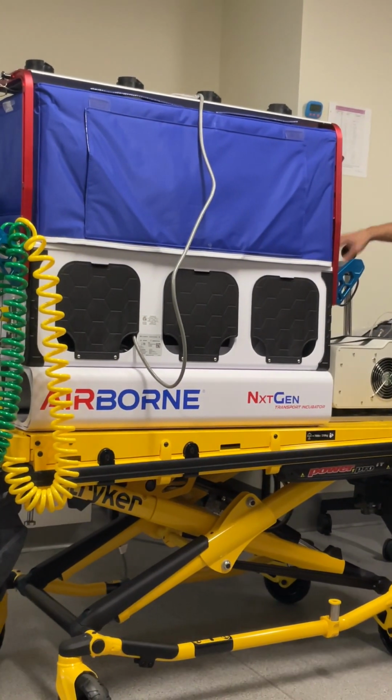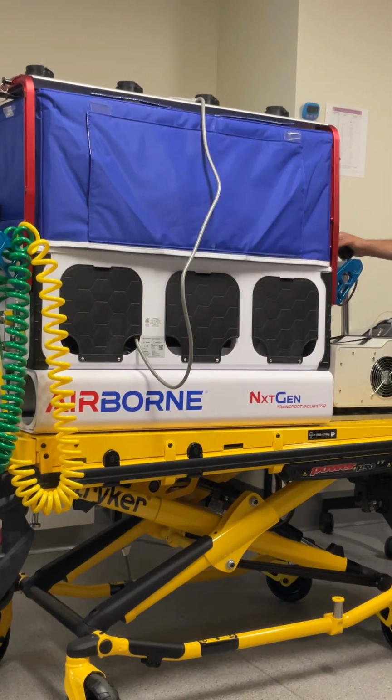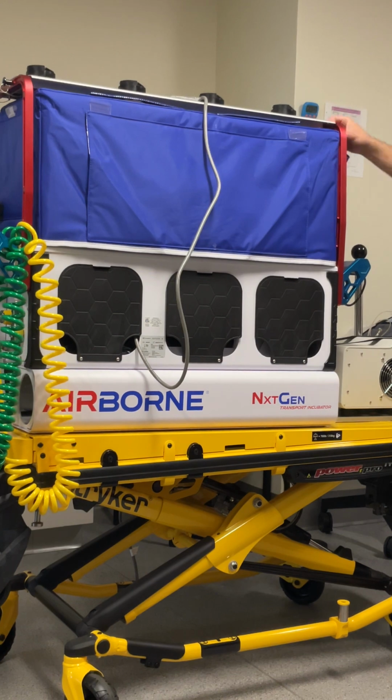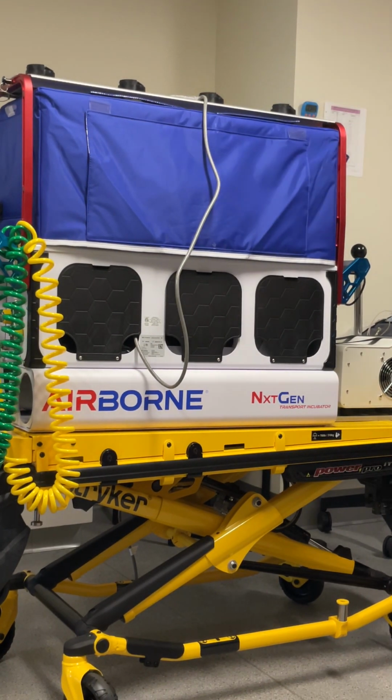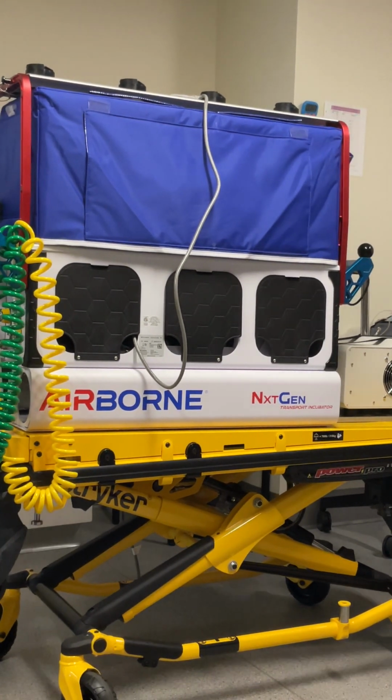So, yeah, that's the back of it. You have your latch, you have your hatch here. The shelf. So this is where our 4 med fusion pumps are. I'll talk about this when we take it off, when we do the clean thing. So maybe just hold on.